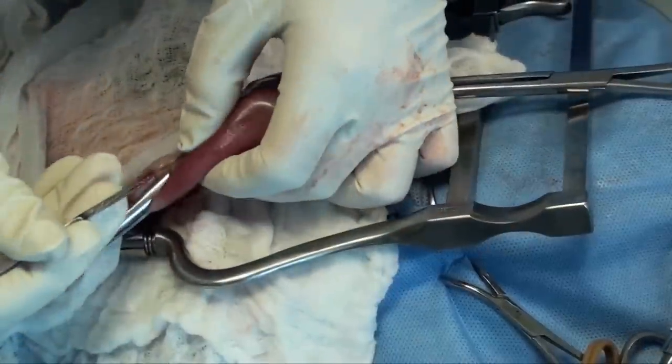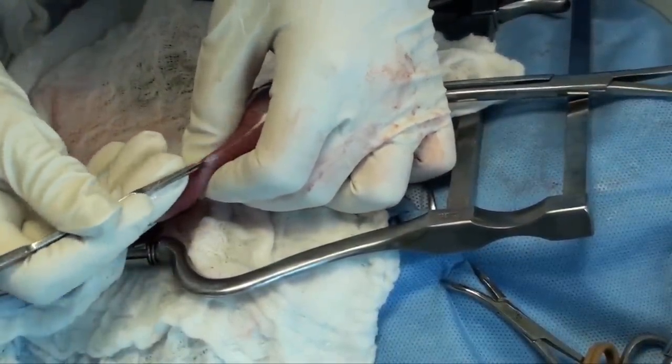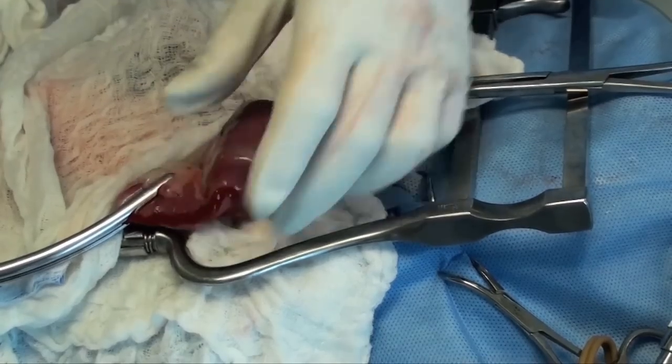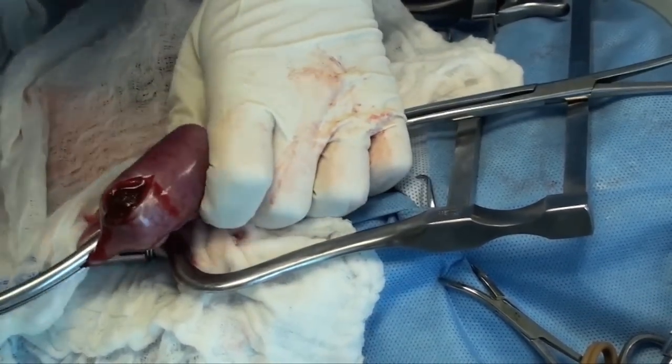In this particular video, we're taking a foreign body out of a small dog's jejunum. Notice I have some doyen clamps placed on the bowel. The foreign body is where it is, but there's no redness, there's very little bruising — it's quite healthy looking tissue.